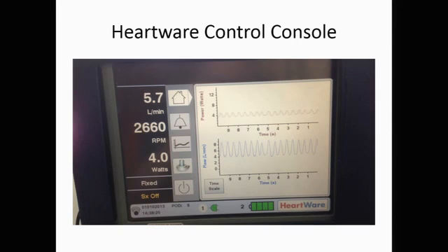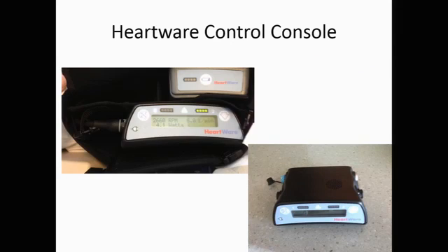This device tells you the watts. It doesn't tell you what the pulsatility index is. It tells you how much power it's consuming. It could tell you what the pulsatility index is, but this company doesn't have the intellectual property required to do that, and so it's hidden in the machine. This is what the portable console looks like.